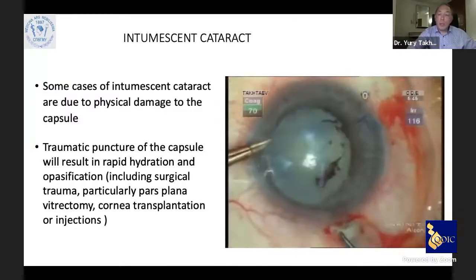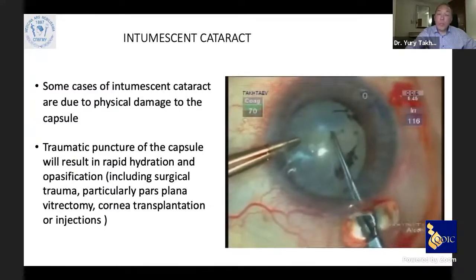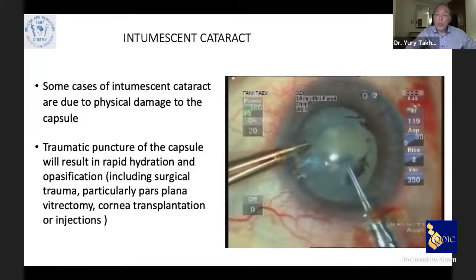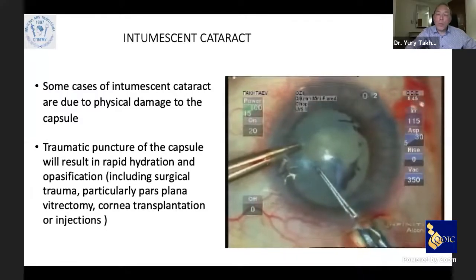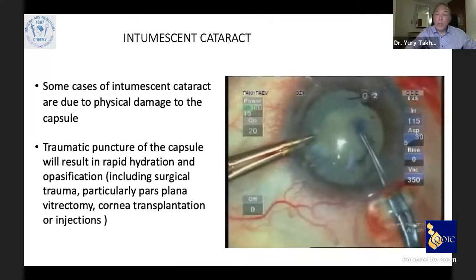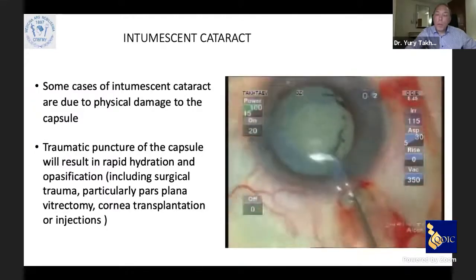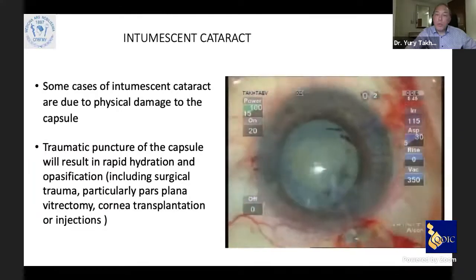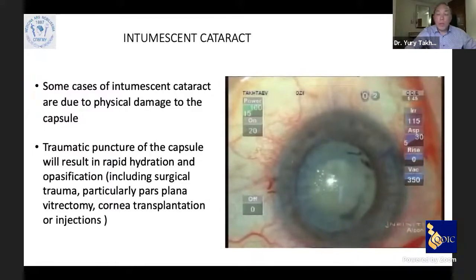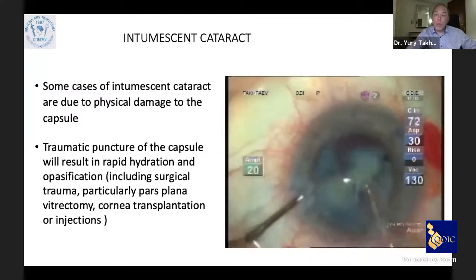And in this case, we just use Hyaluron 5, a very cohesive viscoelastic, and we start to open the capsule with a small rhexis. And this is also one of the points of how to keep control during the rhexis. You can enlarge the rhexis at a later stage, or you can enlarge it during this step. There is no need to hydrate because it's already hydrated. We just rotate the nucleus, and usually the nucleus is not very rough, and you can aspirate it easily with very, very low energy.